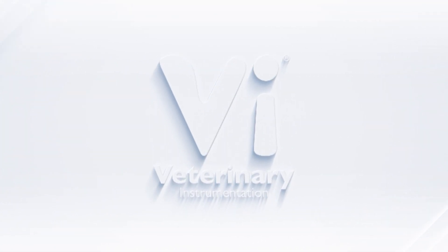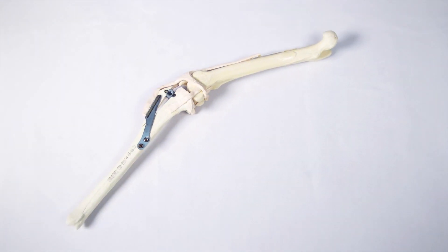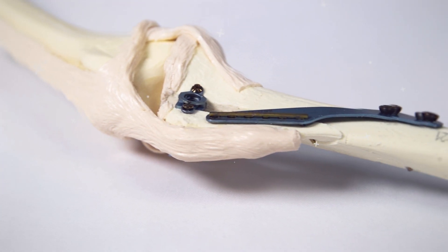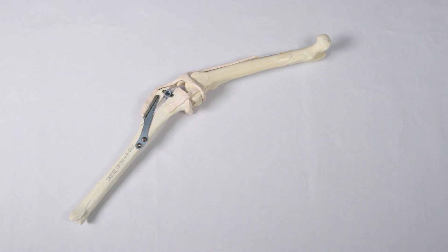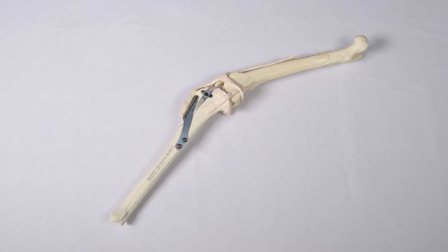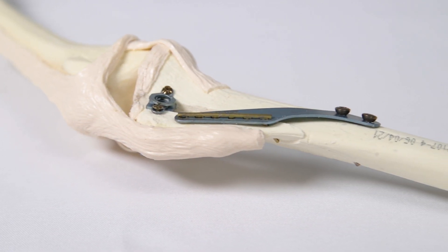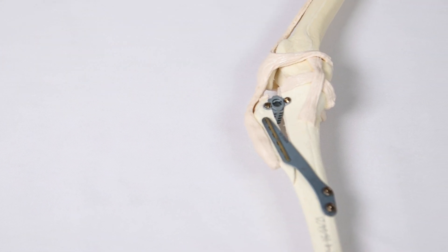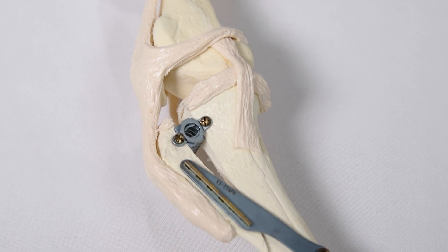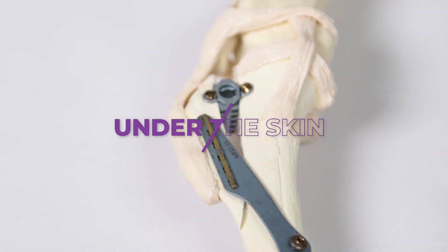Hello, and welcome to Veterinary Instrumentation's latest episode of Under the Skin, a videography series introducing key devices and techniques used during orthopaedic surgery. In this episode, we are looking at the Tibial Tuberosity Advancement Procedure, or TTA, for stabilisation of the stifle following cranial cruciate ligament rupture. This episode explores the traditional TTA procedure using a cage, plate, and fork to alter the functional geometry of the joint during weight-bearing. So, let's go Under the Skin.